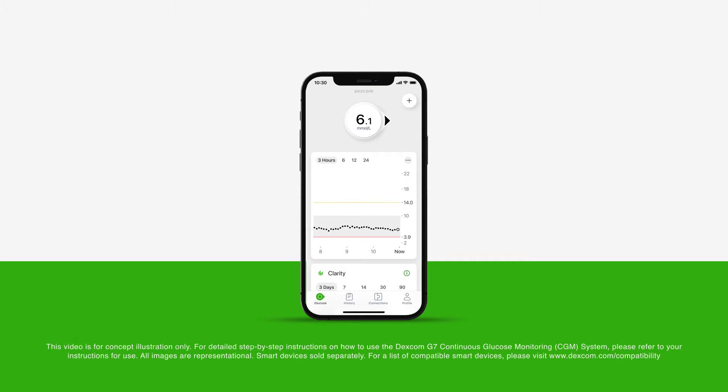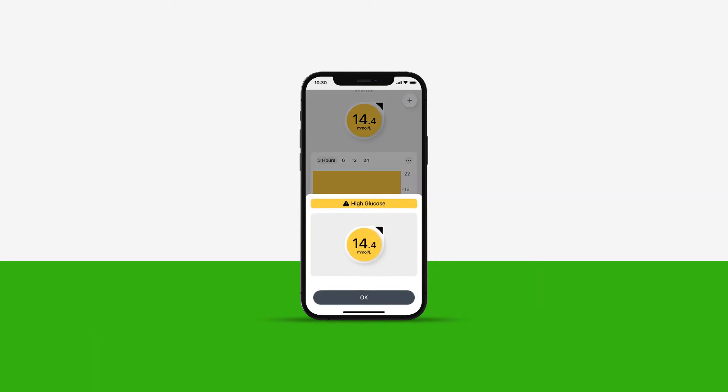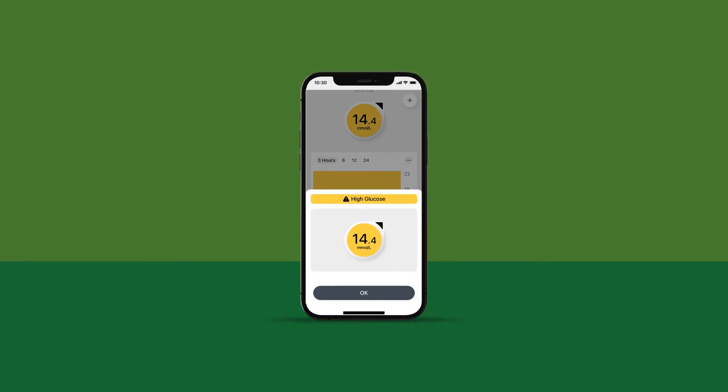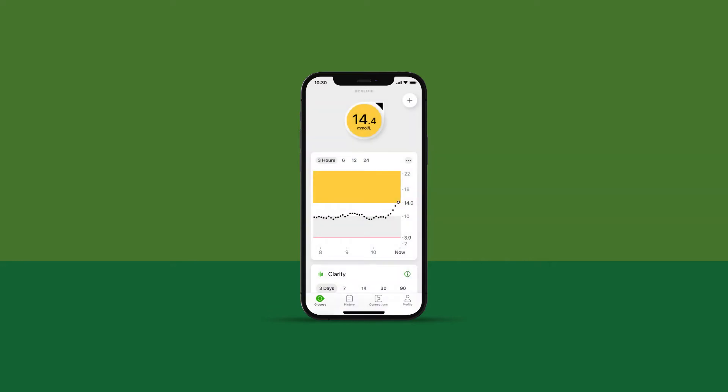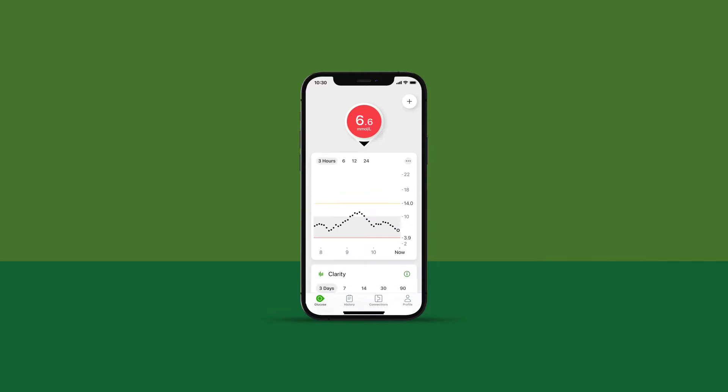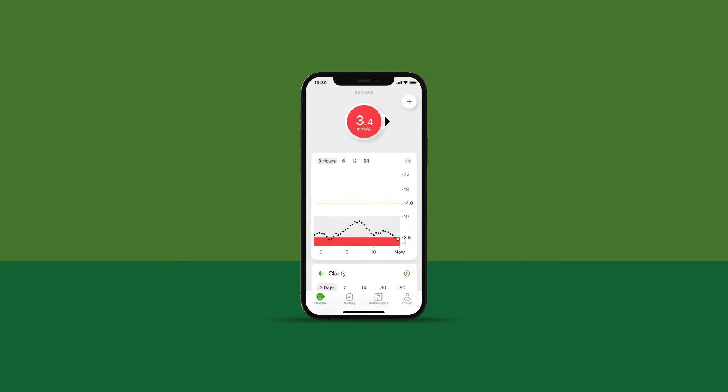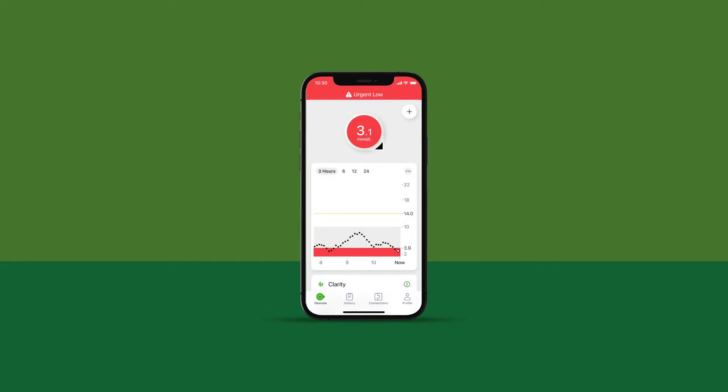Dexcom G7 has a suite of alerts to keep you informed throughout the day and night and can be used to help you reach your goals. This video will take you through each glucose alert available and how to customize them, including the alert mode. Please speak to your healthcare professional for advice on setting your alerts if needed.